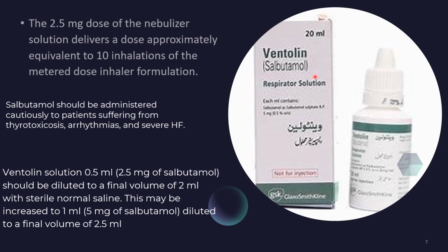So don't be afraid to nebulize with salbutamol, because it is seen that most of our juniors avoid Ventolin due to fear of tachycardia. But actually the tachycardia in exacerbation is usually due to hypoxia in COPD, asthma and other respiratory condition patients. Tachycardia is mostly due to hypoxia.